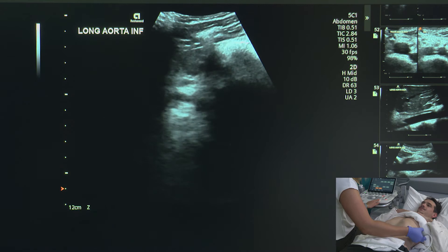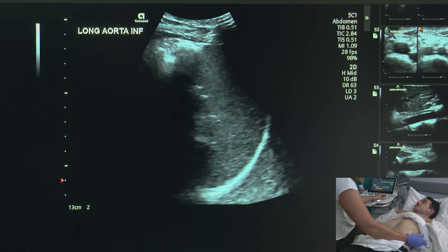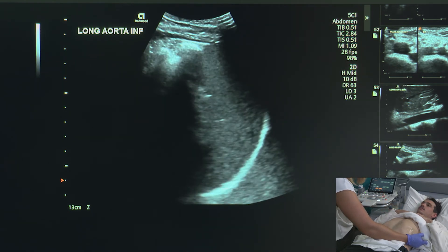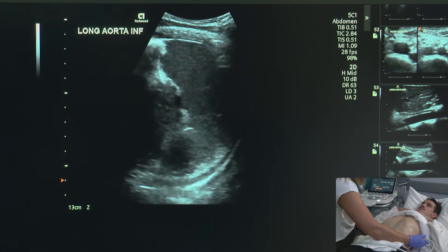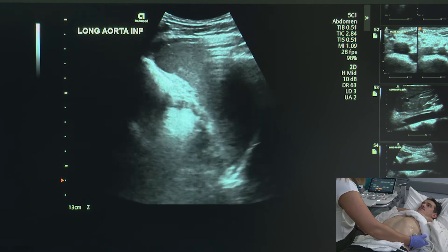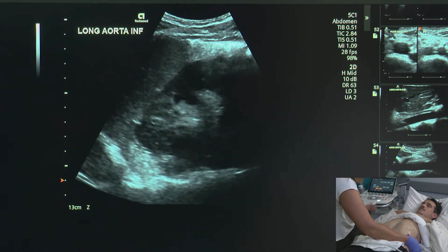Now I'm going to rotate my transducer so that I'm looking at the spleen in the transverse plane, and I'm going to do those same sweeps. Again, I'm making sure that I'm angling between those ribs. Big breath in as I sweep through. The first image that we want to take is one that compares the echotexture of the spleen and the kidney.